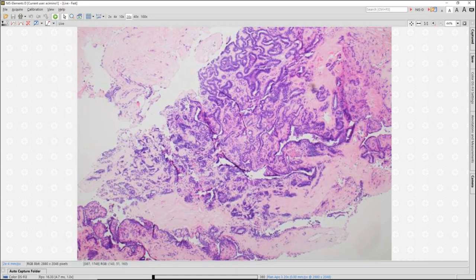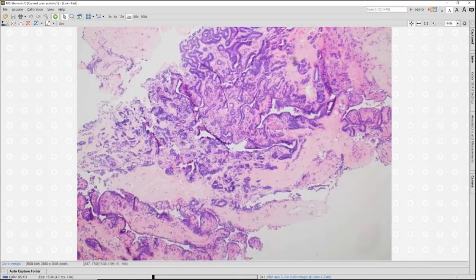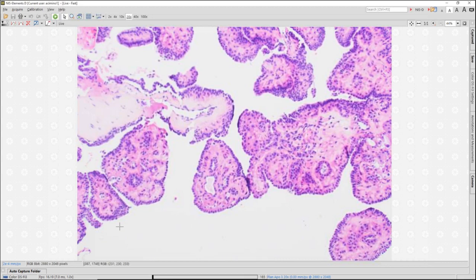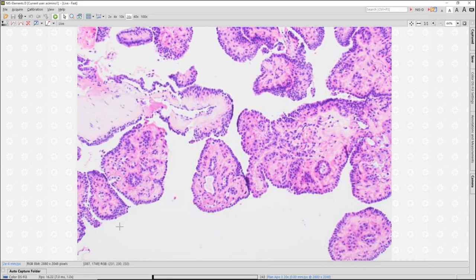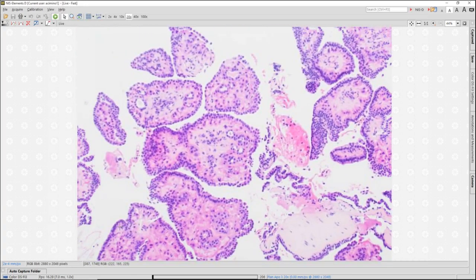This is why I think papillary lesions can be quite difficult to recognize, because as they become more proliferative or sclerotic, they can appear like a solid mass, but it's important to recognize the fibrovascular cores of the papillae, and that they're located within the duct space. This is how we can readily identify them as being actually papillary lesions, as opposed to being more in the solid tumor differential or category.